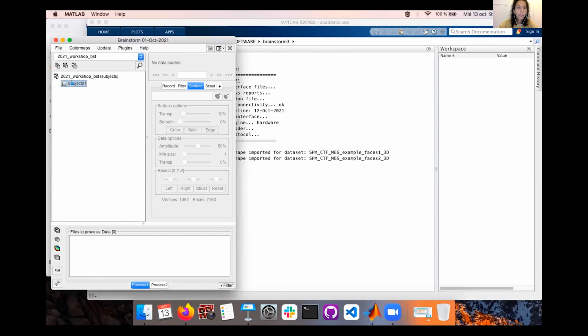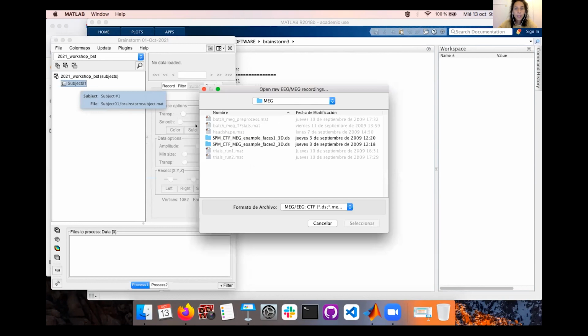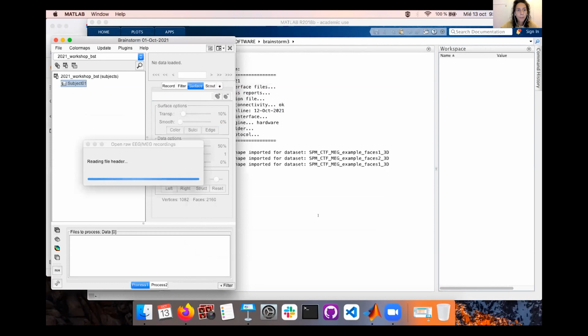And then we'll need to upload the files. So if we say review raw file, in the same way as you may do before, this is the MEG folder that we had, and we just import the two CTF DS folders. So this will be as you usually process your data or load your data.